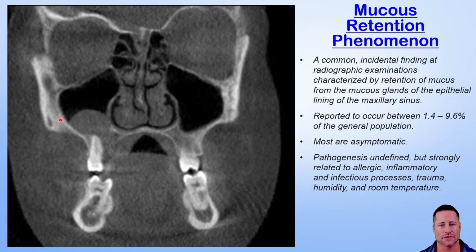These are these sort of little globular shaped opacities, it could be down, up, throughout the maxillary sinus. This patient, you'll also notice, has bilateral turbinate hypertrophy and a high vaulted palate, insufficient space for the tongue. It can't sit up into the palatal vault. So again, a lot of the things that we talk about and look at, not an accident they have a posterior crossbite. This is where it all starts to come together. And in my lectures where I talk about how everything is interconnected, and we talk about that a lot, this is a classic example of it.